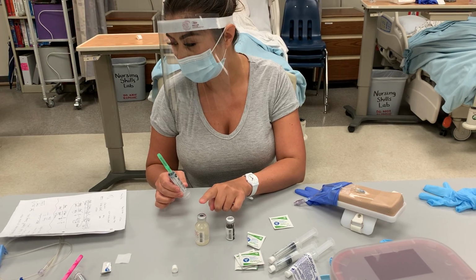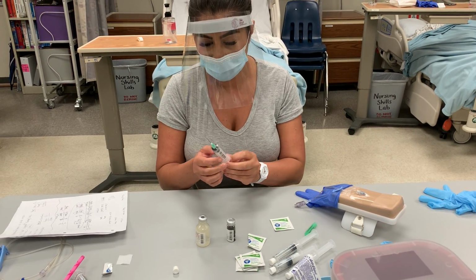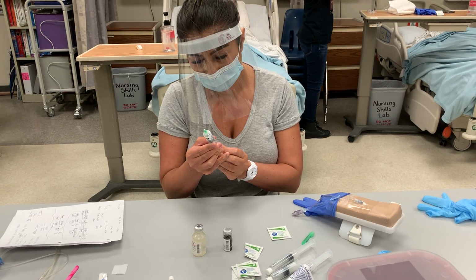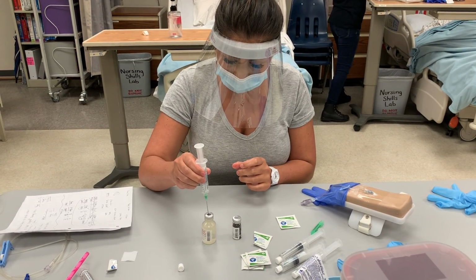So for my diluent, I'm taking 5.2 mLs, so I need to draw up 5.2 mLs of air. I'm going to go ahead and put the air in there.